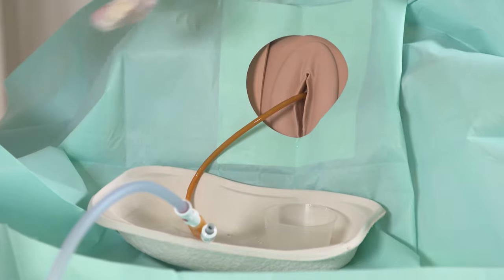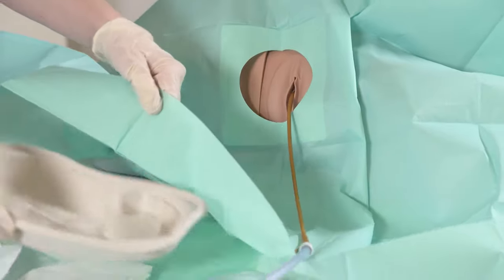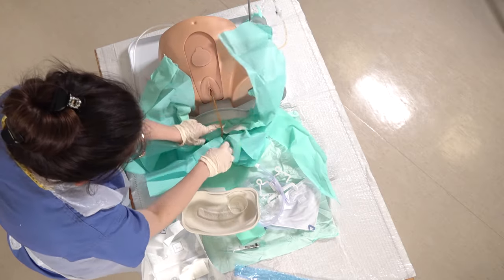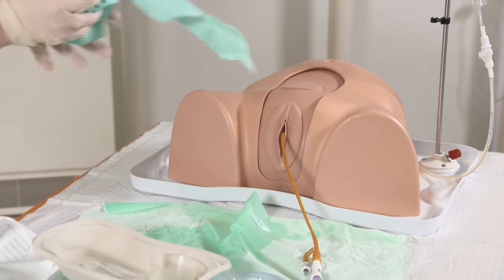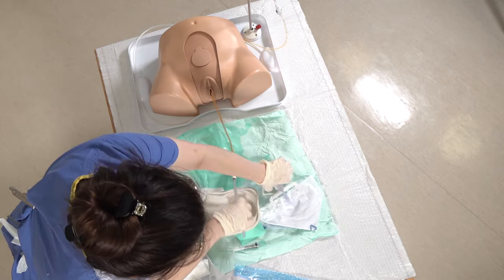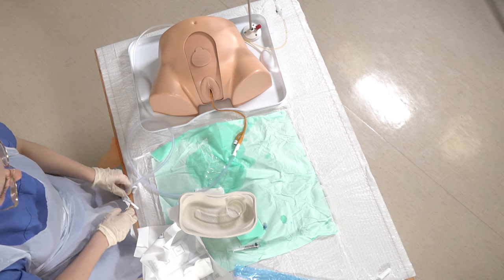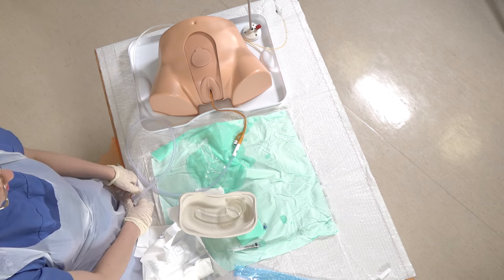Remove the gauze and then you can remove the drape as well and the kidney dish by just tearing it, then remove the catheter bag itself. You want to attach that down to the side of the bed, then measure the residual volume, and obviously we recover the patient at this point.